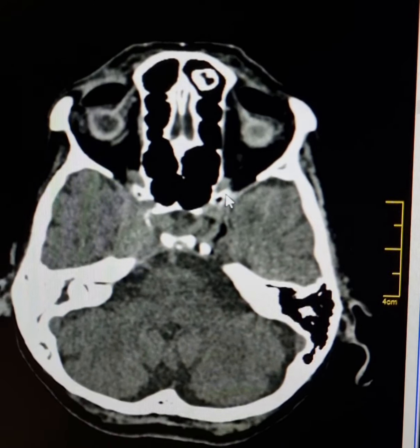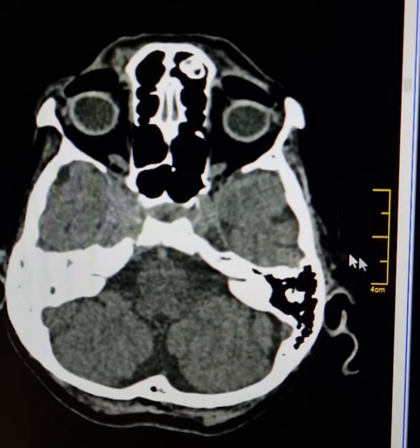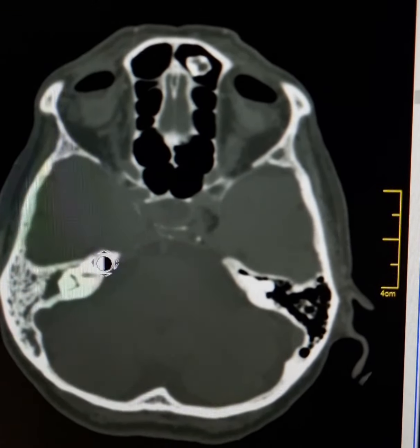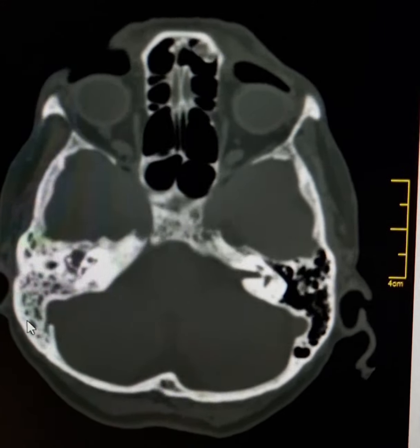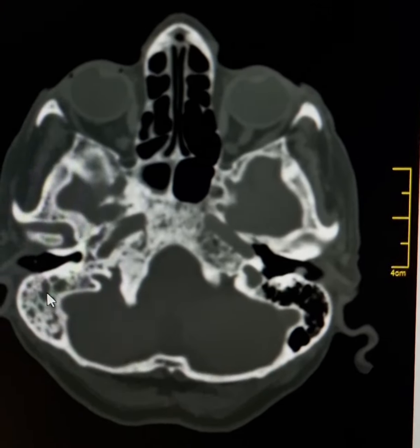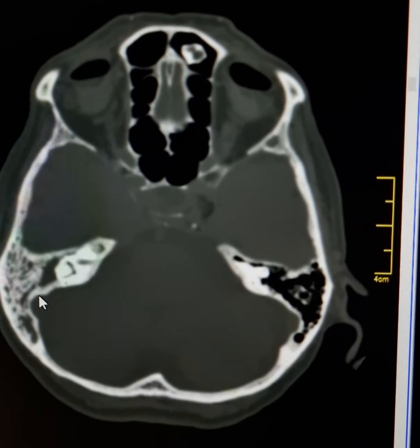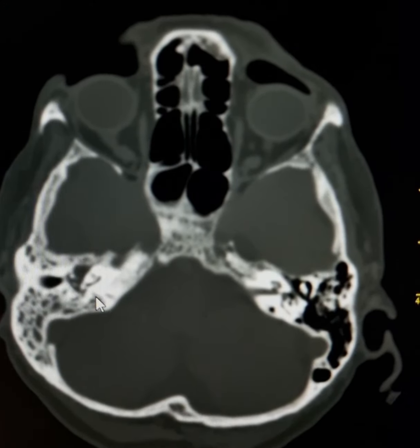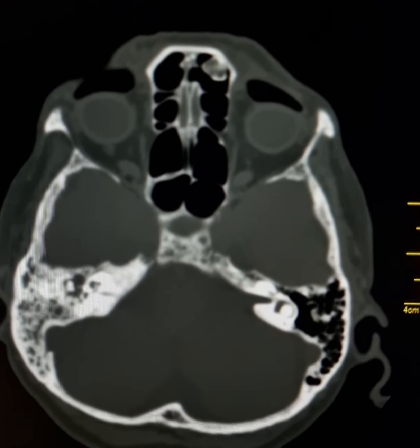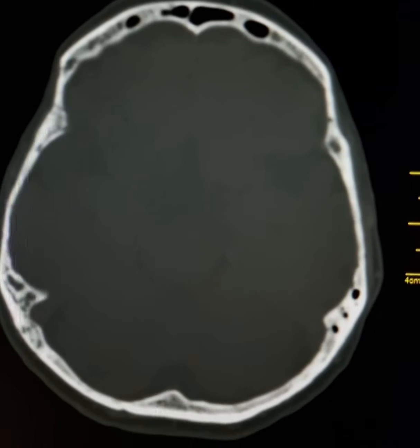Please observe this soft tissue density shadow here. This is the right mastoid — it is cellular, but the mastoid air cells are occupied by soft tissue attenuation, and the same is the case with the middle ear cavity. So there is mastoiditis and suppurative otitis media on the right side.